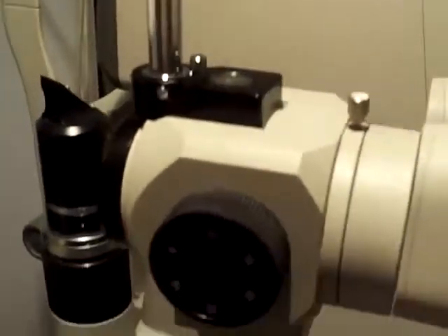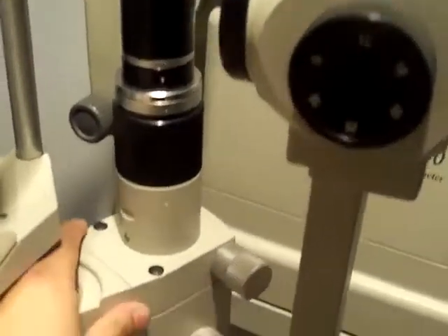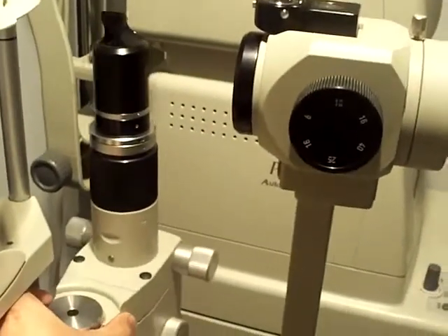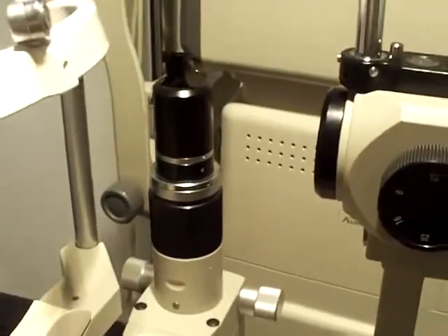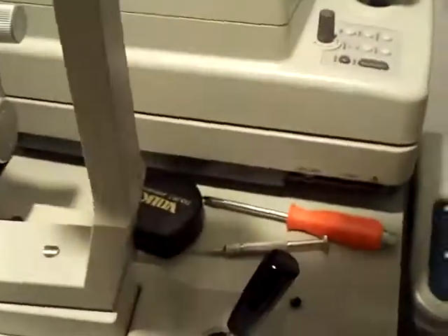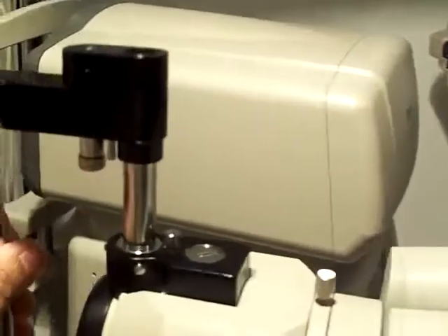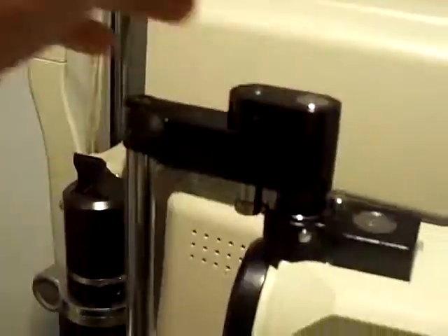Before you mount your R-Type Tonometer, make sure the illumination arm is as far away as possible, otherwise you will cause damage to your illumination arm. Simply pick up your R-Type Goldman Tonometer, place it on the mount, and push it in place.